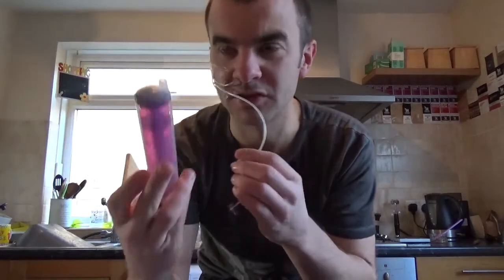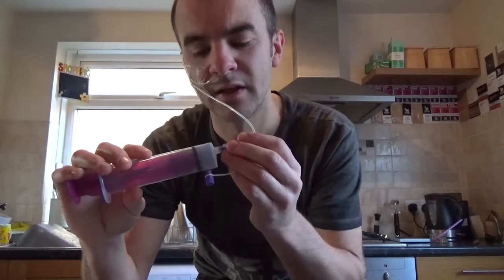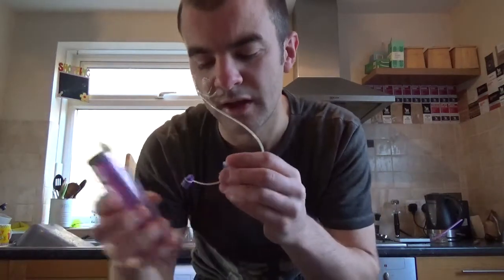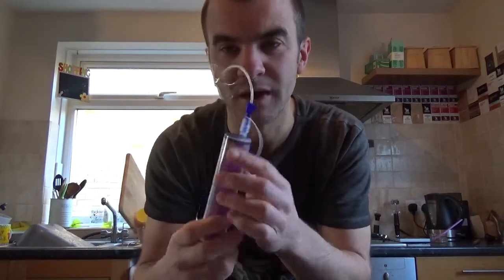What you do is get your syringe and push in about 10 mils of air. That's just to make sure you clear any contents that are in the tube so you don't get a false positive. I've done that, and then you attach the syringe to the tube.